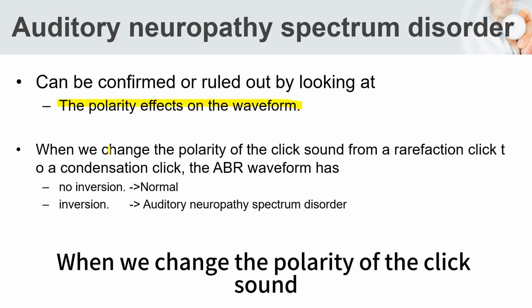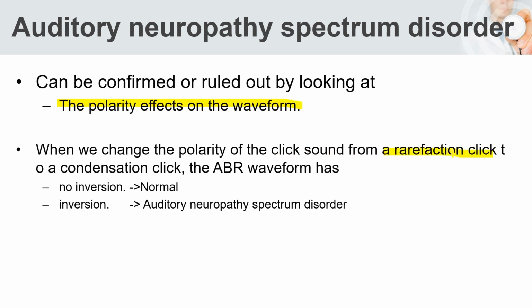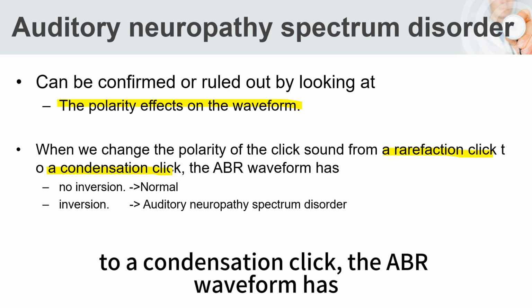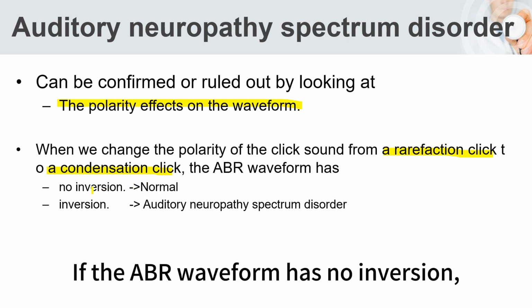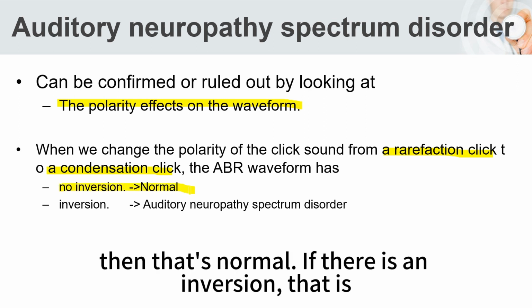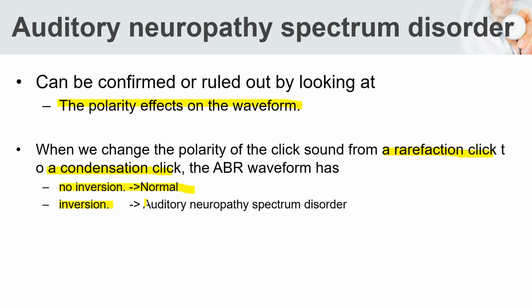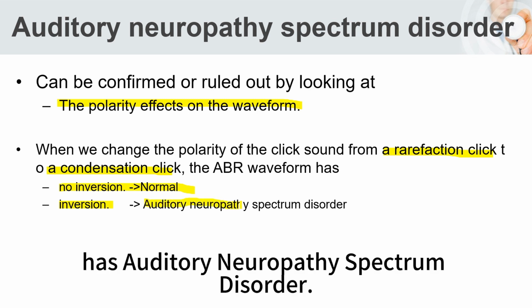So when we change the polarity of the click sound from a rarefaction click to a condensation click, the ABR waveform has no inversion or inversion. If the ABR waveform has no inversion, then that's normal. If there is an inversion, that is telling us the baby probably has auditory neuropathy spectrum disorder.